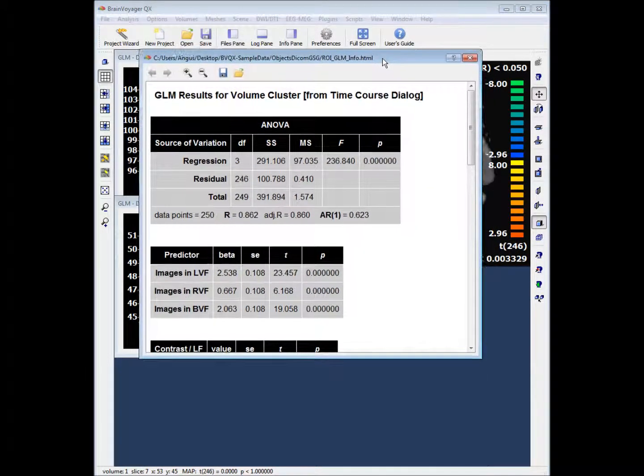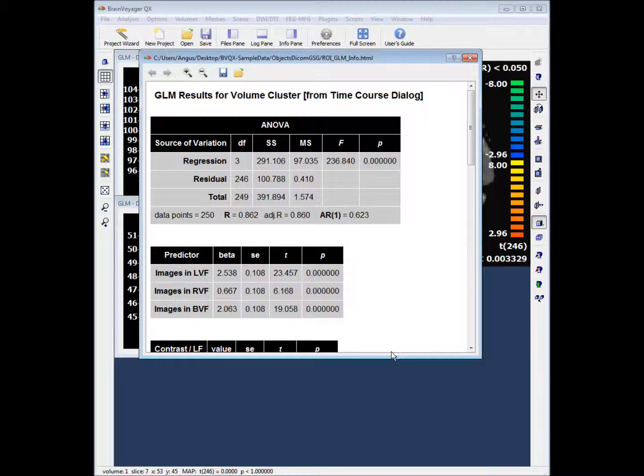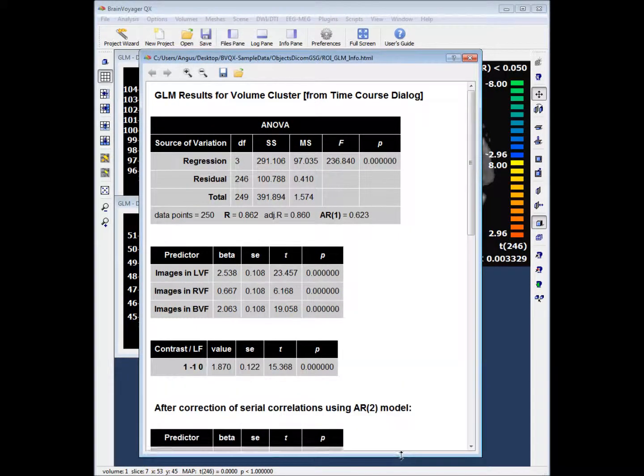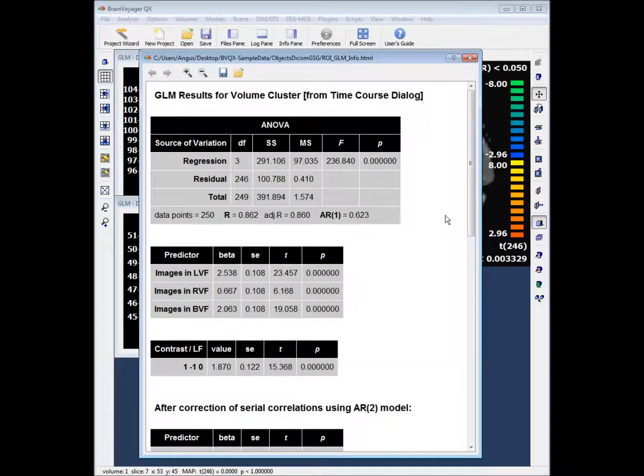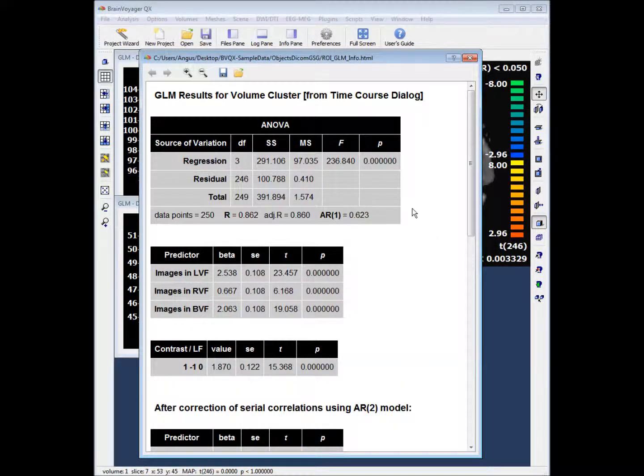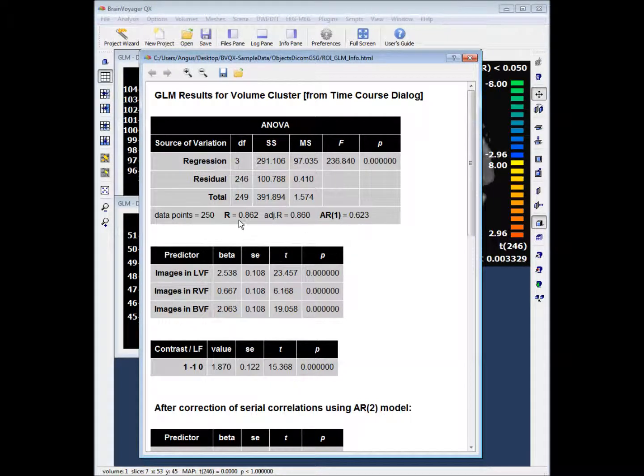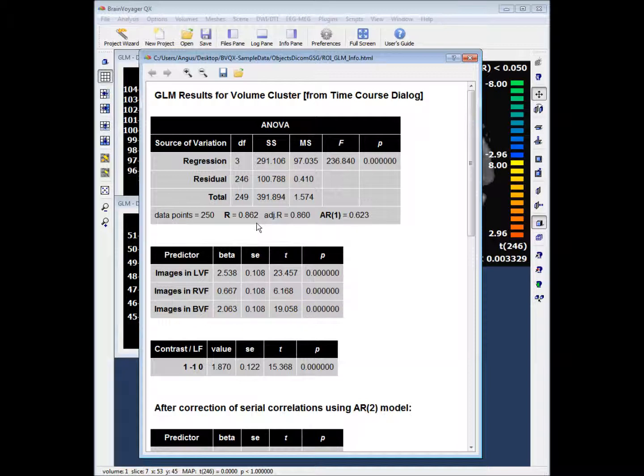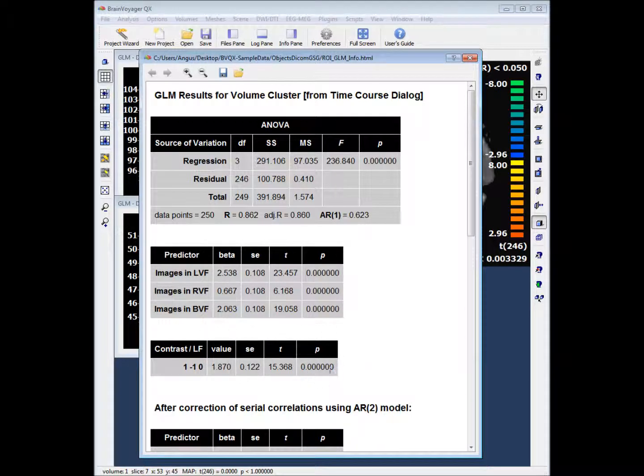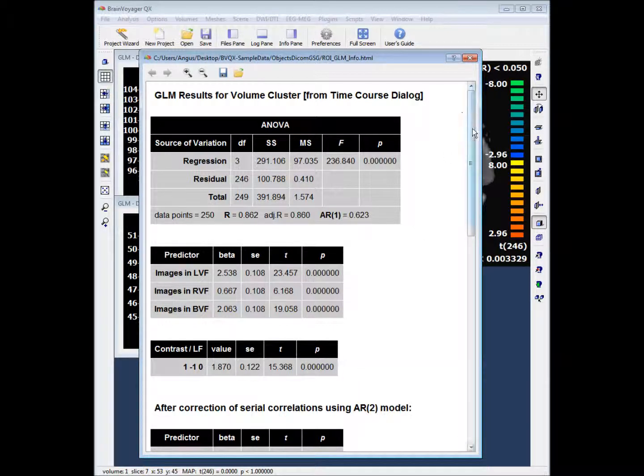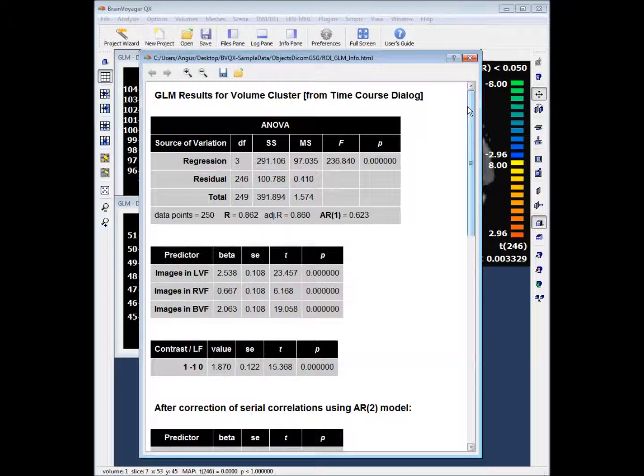This provides us with some tables and graphs. If we look at the tables first, in the first table we have our ANOVA with our degrees of freedom and our f-statistic. At the bottom we have our correlation r coefficient which shows us how well our model fits the data. In the second table we have our beta values for our predictors. In the third table we have a p-value relating to our contrast. These tables are repeated below for correction of serial correlations.